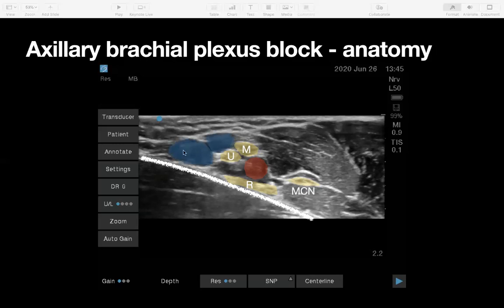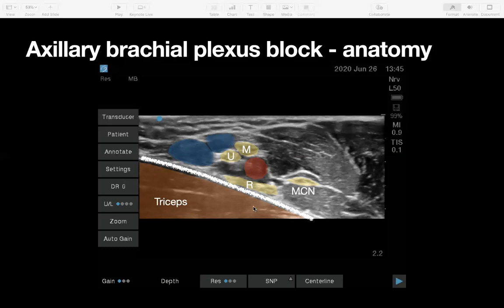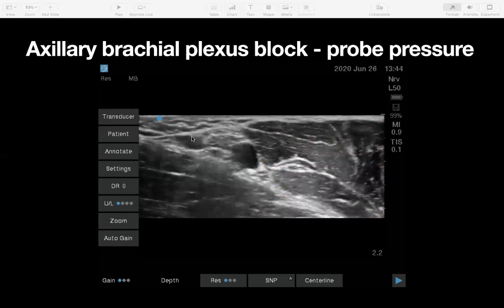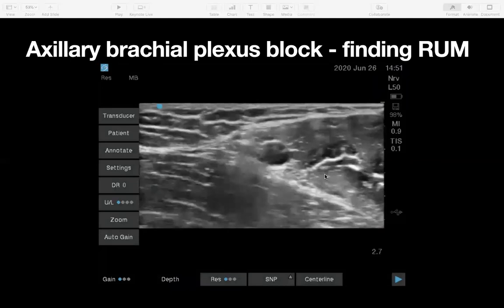You've also got veins — the axilla is normally quite a vascular region with lots of veins. You need to be aware of where these veins are, because depending on probe pressure they can easily be obliterated. If you're holding the probe with a bit more pressure, you wouldn't know they're there. So you want to relax the probe pressure and find out where those veins are.